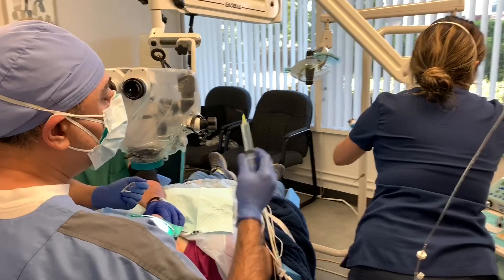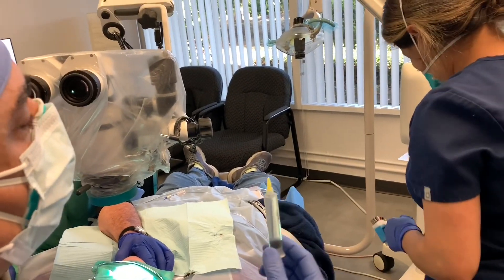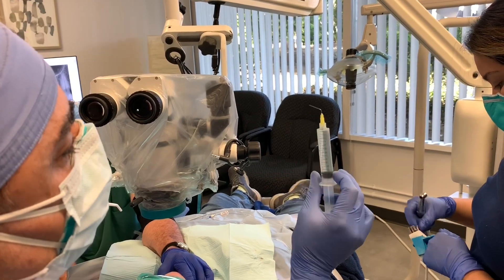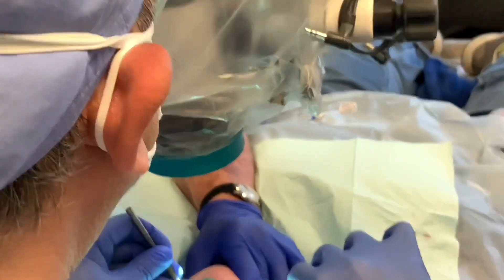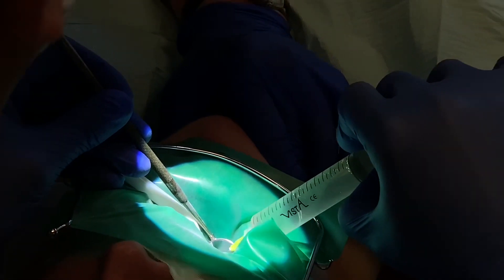Now that I've opened and flared the canals two-thirds of the length with the stainless steel flare file, I can go in with my blue hypo needle deeper. Let me have the hypo needle.